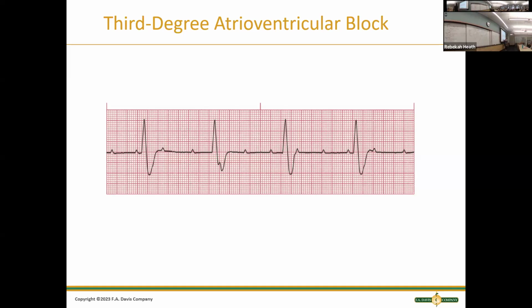So if you look at it, the P waves, we could measure it where it's equal. Here's a P wave and another P wave. And if we move over here, oh look, you might think that's a T wave, but it's not. Still here. Ooh, look how this looks different. It's because my P wave is hidden in here. And then if I move on, it's still the same. The P waves march out the same all the way through. The QRS complex also marches out where it measures.